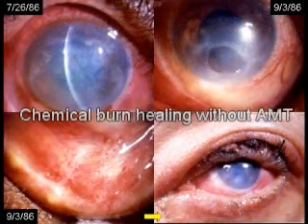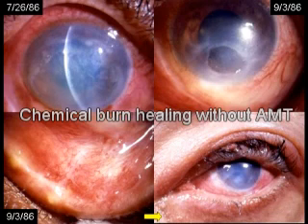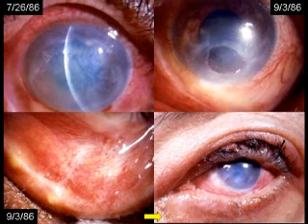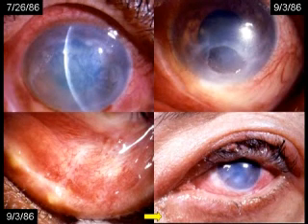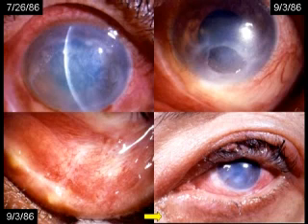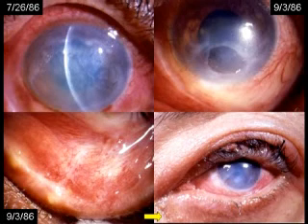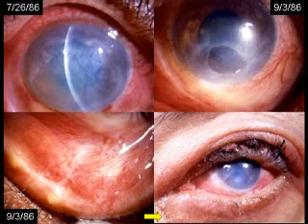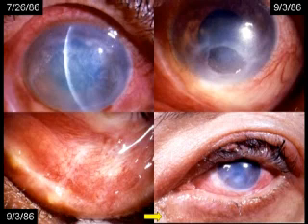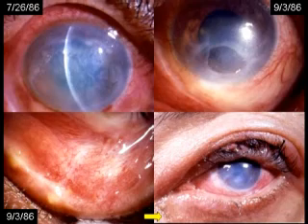Without using amniotic membrane, as shown in this case, the persistent corneal epithelial defect already lasted two months before July, and in the ensuing two months continued to have slow healing resulting in limbal epithelialization and scarring, which then required additional surgery. The secondary complications due to chronic inflammation become much more difficult to manage in patients without amniotic membrane transplantation.